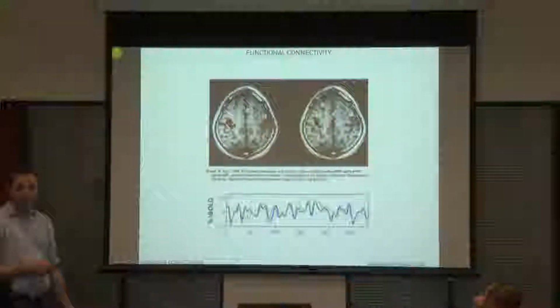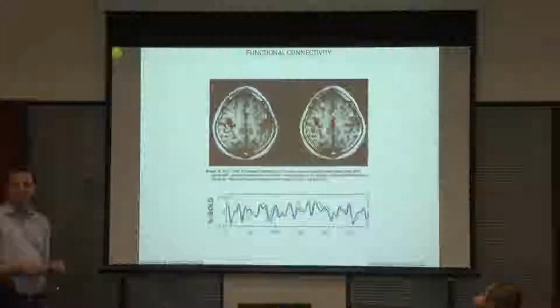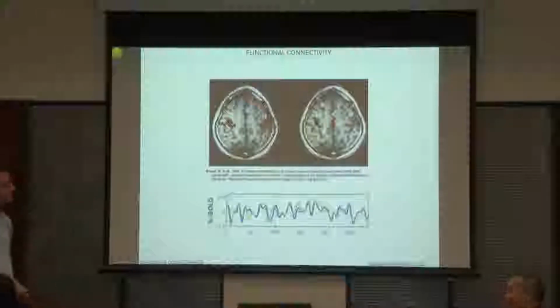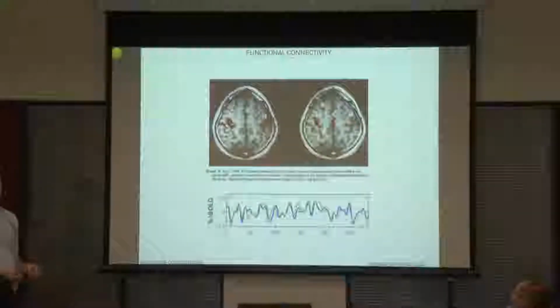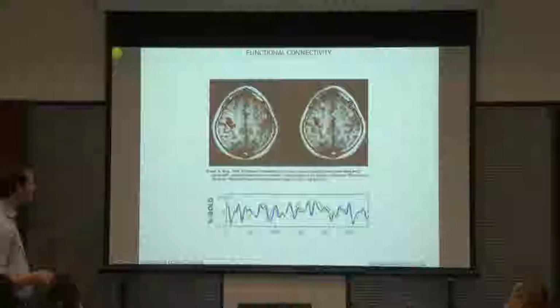And functional connectome is often based on resting state fMRI, and it's also a terrible method. It's also the only one we have, really. So we have two terrible methods, and these are the only ones we can really use without cutting the brain open. But we really should bear in mind that they are not good methods, even if you have a very great processing pipeline.